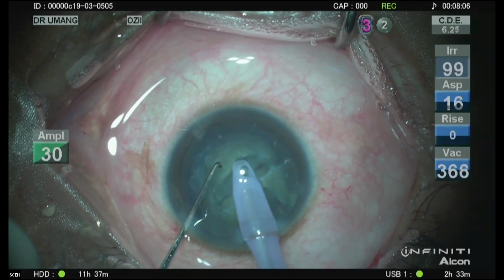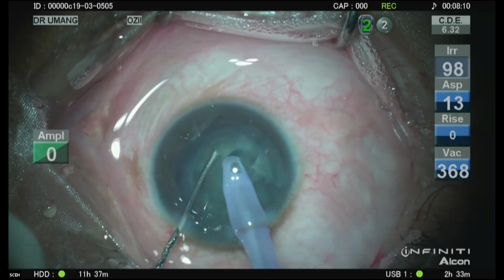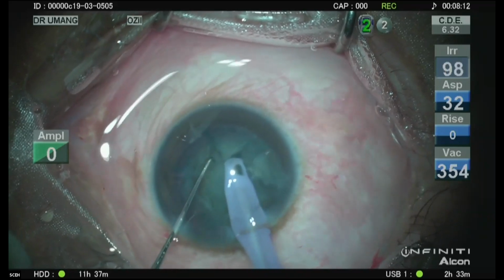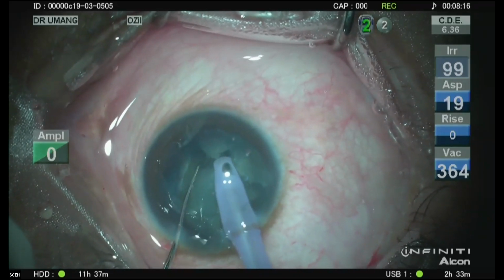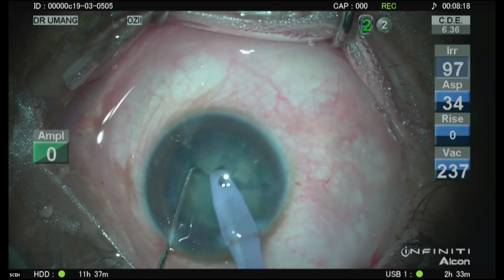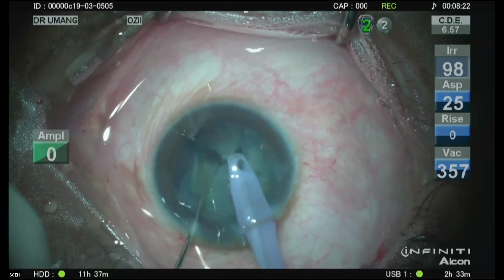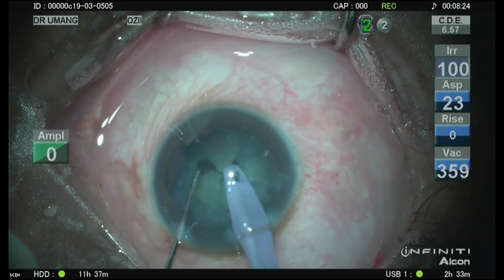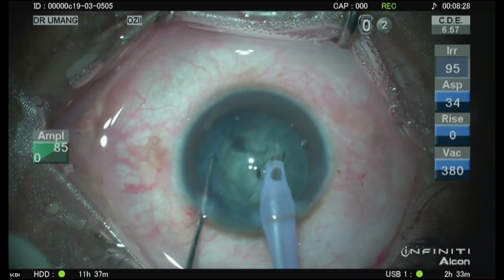So we hold again, dip down, we get half a crack, then you go further in the crack and separate. I'm still not sure whether I've got it completely. And so I want to be sure every fiber has got cracked. And you can see I'm not excursing too much.